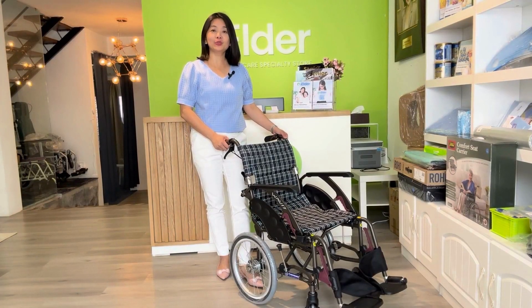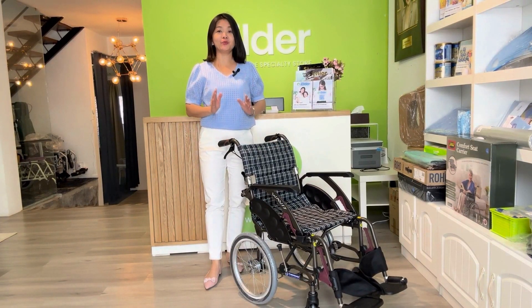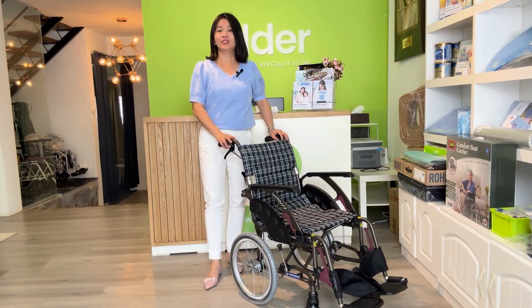Hi, my name is Olivia. Today, I would like to share with you a very nice economic wheelchair from Japan. It's called Kawamura WAP-16.